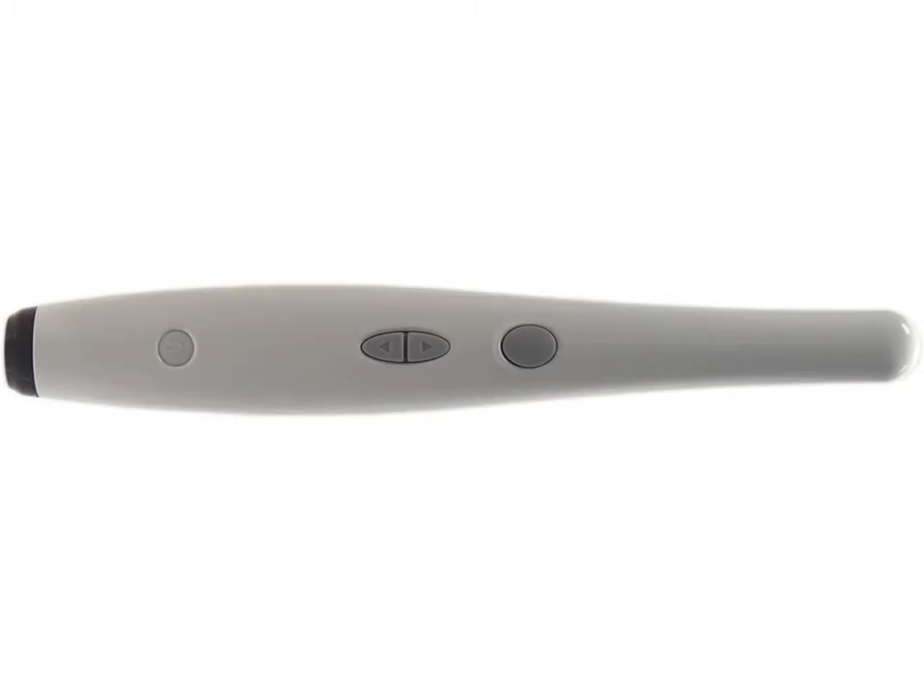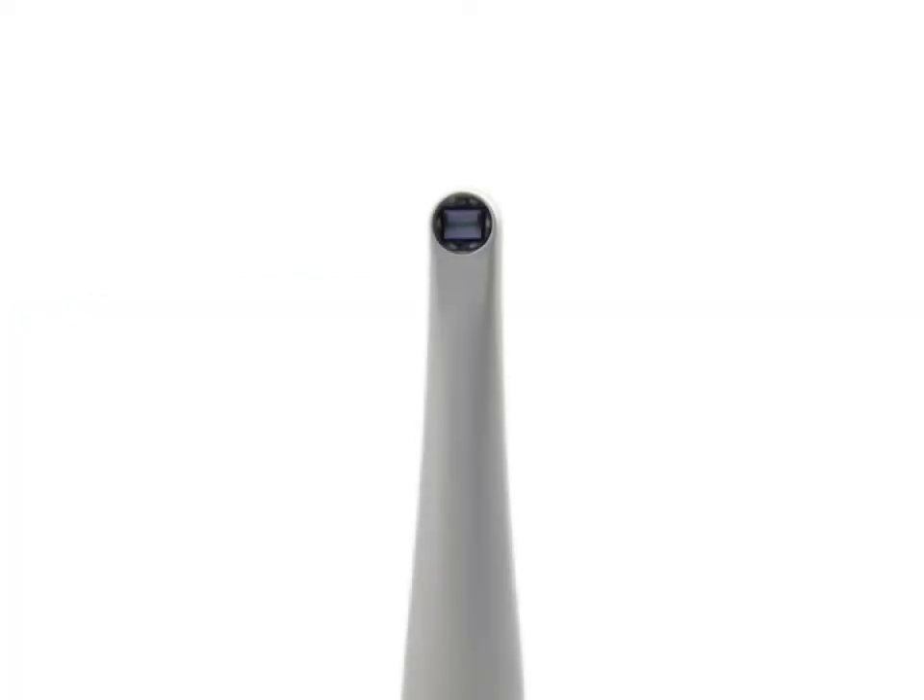The camera contains all the electronics and controls used to capture images and record video. It is shaped to fit in the hand comfortably, and all but eliminate slipping. At the business end of the camera, under a protective window, reside the LEDs, the camera lens, and the electronics that digitize the images and video.